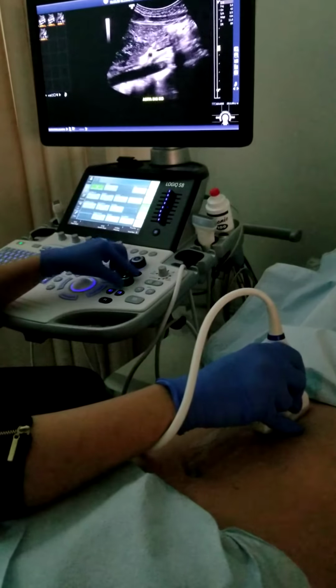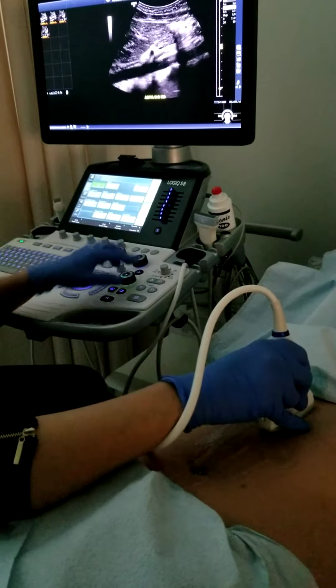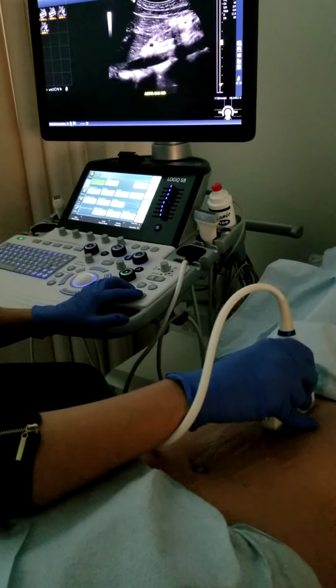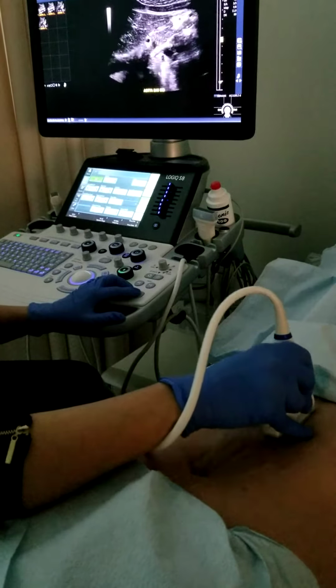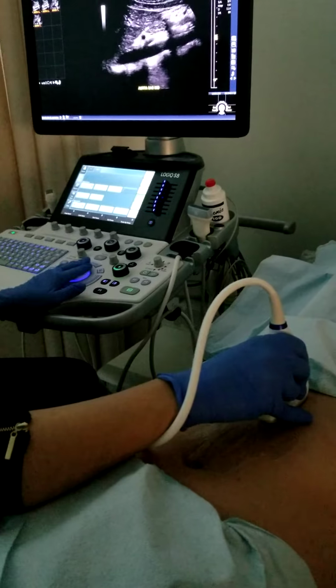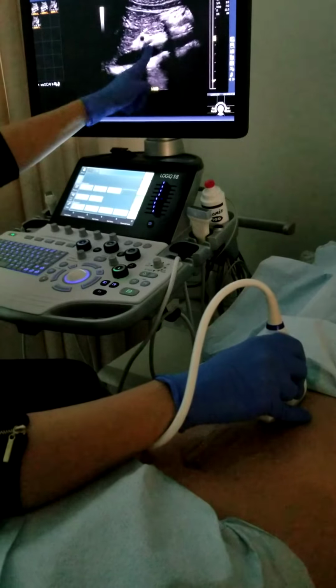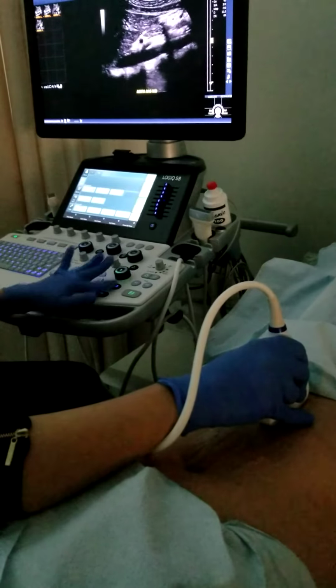I may not have to have my patient breathe in for this, because remember we're coming toward the midsection. Not all the time do you have to have that diaphragm pushed down anymore. Okay, please. If I measure from here to superior, that's going to be incorrect. If I'm at mid, I have to measure from this SMA takeoff and inferior.